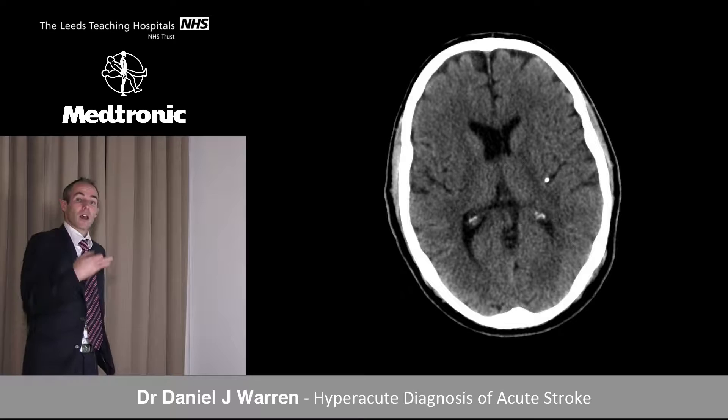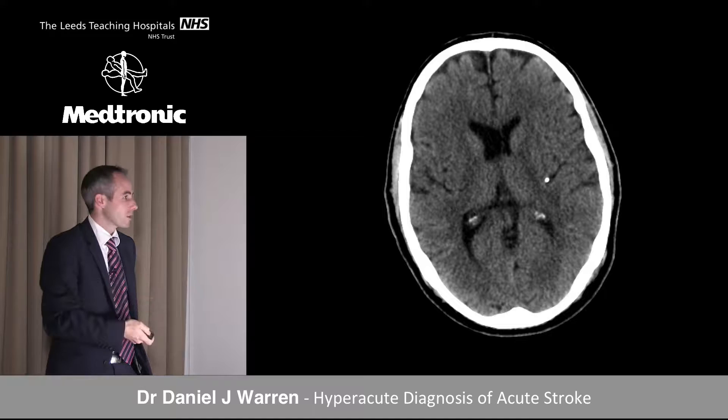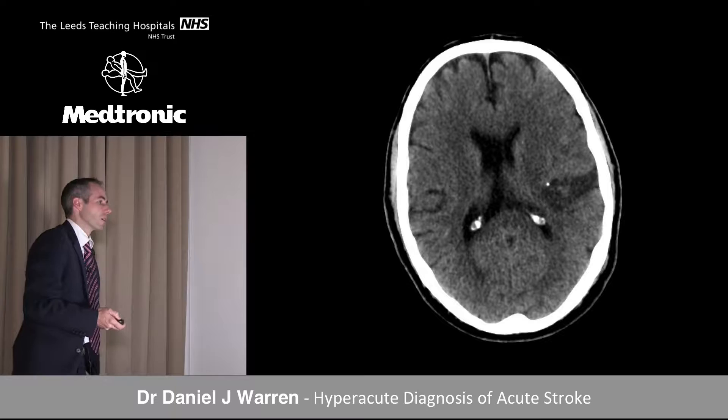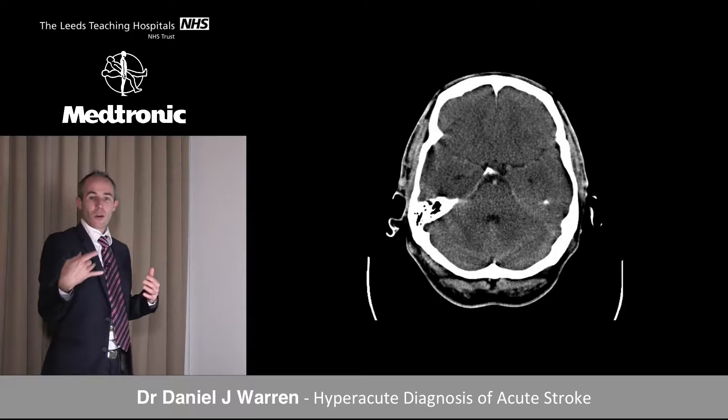Sometimes thrombus can appear really bright — calcific density. In one scenario, a patient had had an aortic valve repair with a heavily calcified valve. Immediately post-procedure the patient had nominal aphasia. Delayed imaging the same day showed the area of infarction distal to the thrombotic occlusion from the heavily calcified embolus.